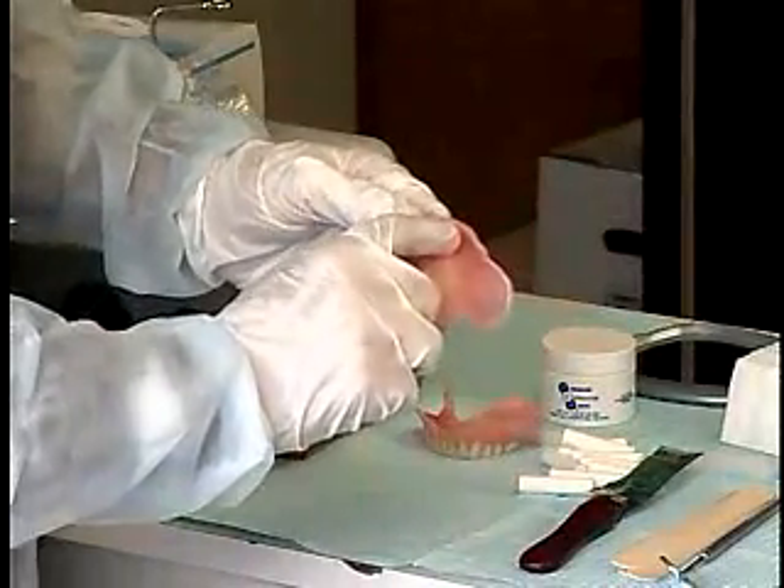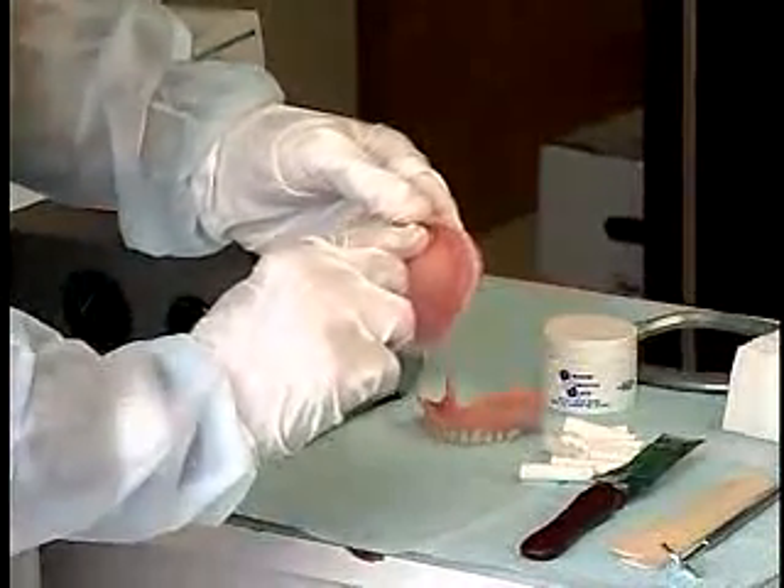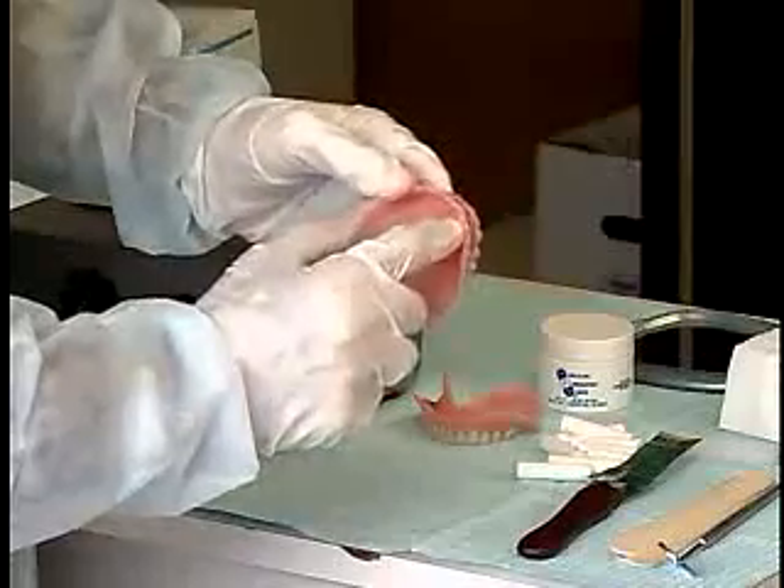Use your fingers to feel any sharp projections, blips, or rough areas that would injure the patient, and remove them.